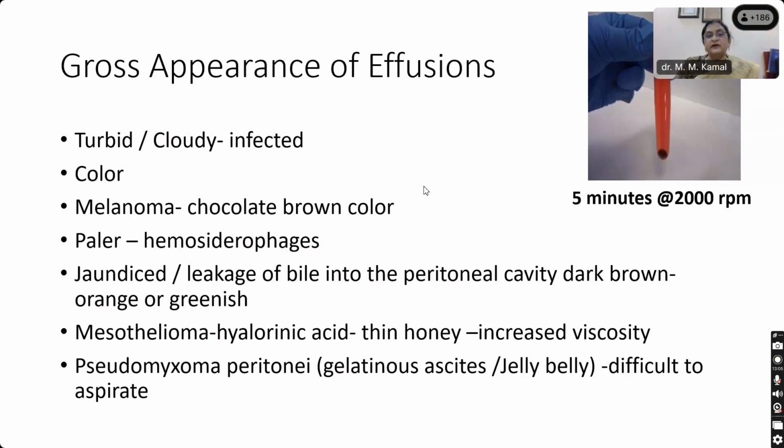Once the technician receives it, I personally feel that residents should be interpreting the fluids in terms of their gross appearance. Is it turbid or clear? What is the color? Because each of these things will give you some amount of information.